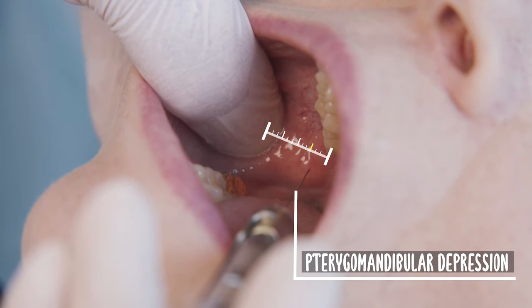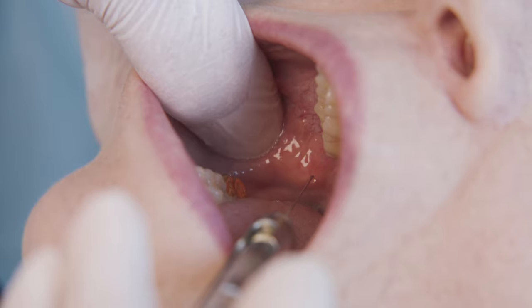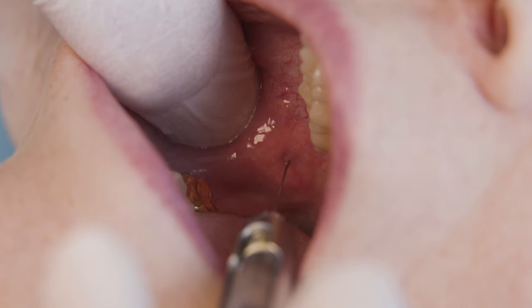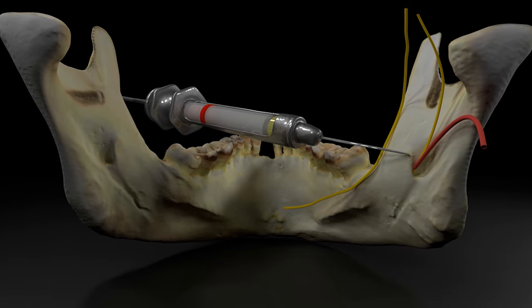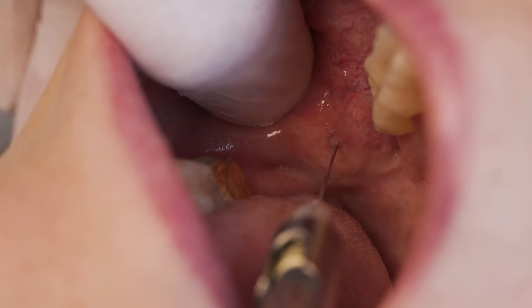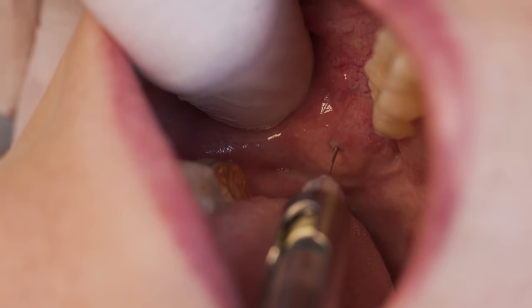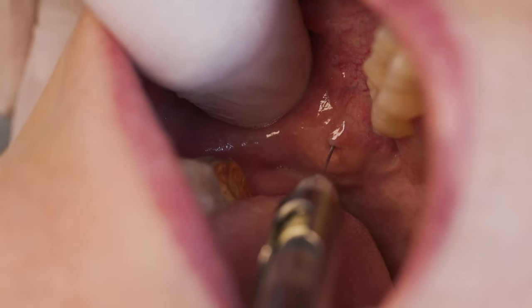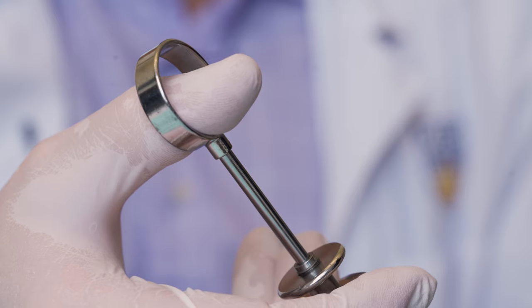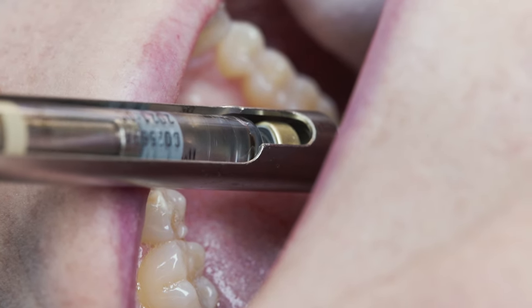I move the syringe towards the insertion point from the contralateral premolars. You should advance the long needle slowly, about two-thirds to three-quarters of its length, until you make contact with bone. Now, pull back about one to two millimeters to prevent a painful subperiosteal injection. Don't forget to aspirate to ensure the needle is not in the blood vessel, which runs along the nerve. Once aspiration is negative and you're certain the needle is in the right spot, slowly deposit 1.5 milliliters of anesthetic around the inferior alveolar nerve.